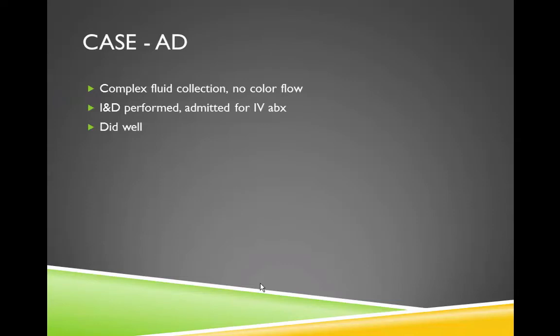So that's what we got there. And we didn't mention it, we didn't really show it, but we also checked to make sure there was no color, no big vessels right in the path of our knife, and that's an important point. Anytime you're about to stick a knife somewhere, put color on it and make sure there's not a big blood vessel right in your path. And again, this patient did well.